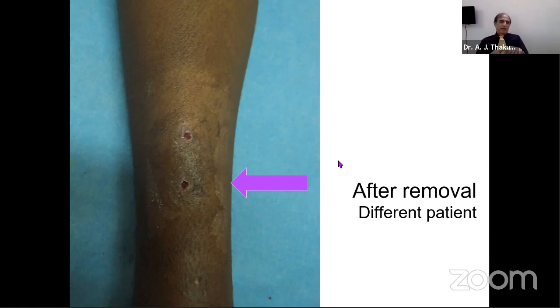I never apply any ointment around the skin because that closes the passage. It doesn't allow the discharge to come out and doesn't serve any purpose. So, in fact, I apply nothing there. Occasionally, if something is required, soap and water, that's all that is required, nothing else, no disinfectant, no chemicals, nothing.